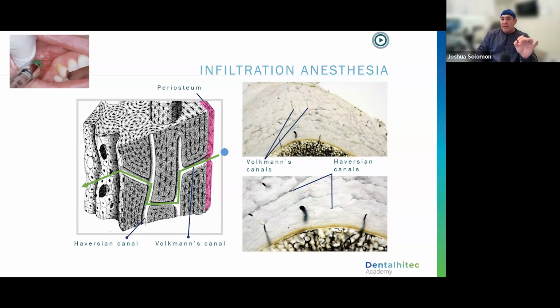Administration of local anesthetic via the intraosseous route is not much different than what you've been doing since day one of being a dentist, okay? So when we gave a standard infiltration, when you lifted that patient's cheek up and, in the vestibule, delivered half a carpule there, what you need to realize is that eventually that bolus of local anesthetic got to the nerve somehow. How did that happen?